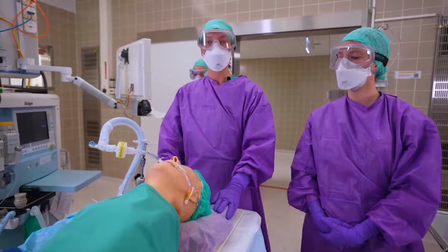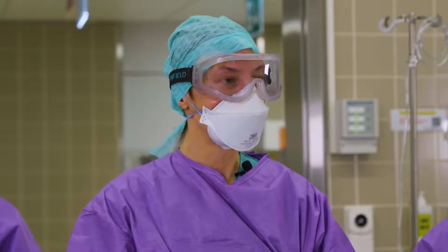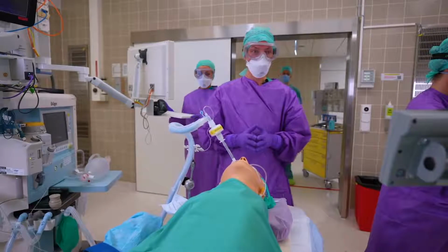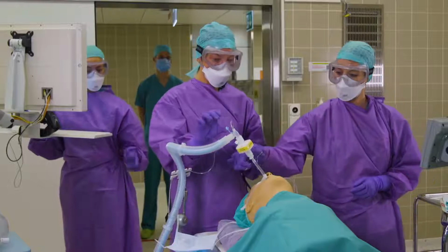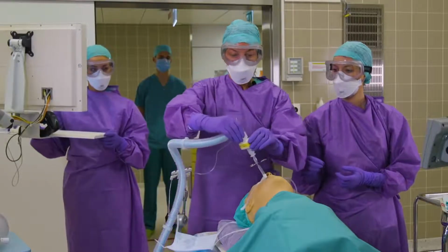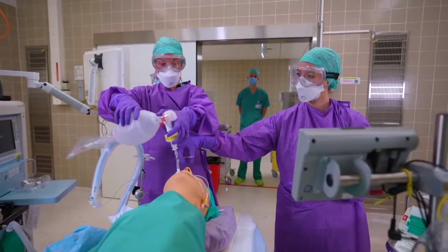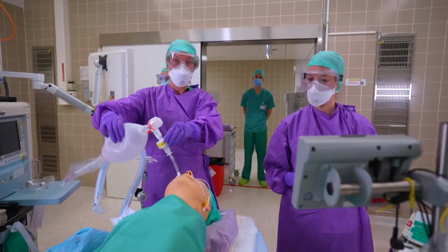Intraoperatively, we are utilizing lung protective ventilation strategies, i.e. a tidal volume of 4 to 6 cc's per kilogram ideal body weight and a PEEP. If you're transporting an intubated patient to the ICU, make sure that you clamp the endotracheal tube in inspiration before you disconnect and reconnect to your bag valve mask. We are saving our transport ventilators for use in the ICU, and hence currently we are utilizing bag valve masking for transportation of ICU patients.